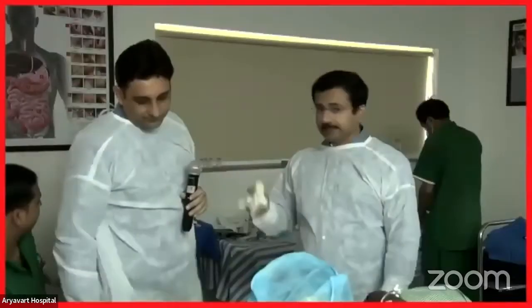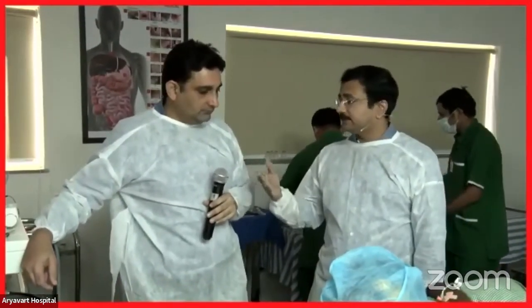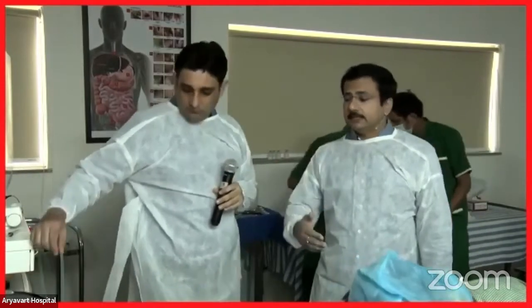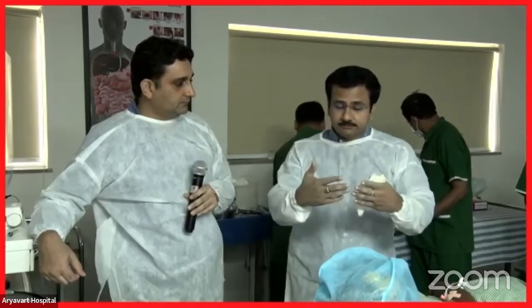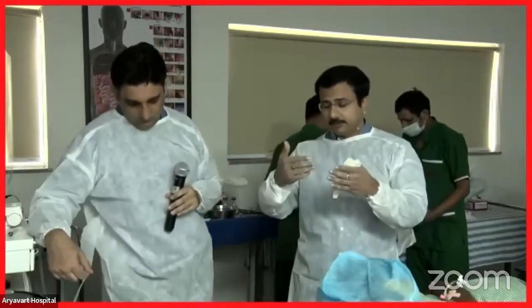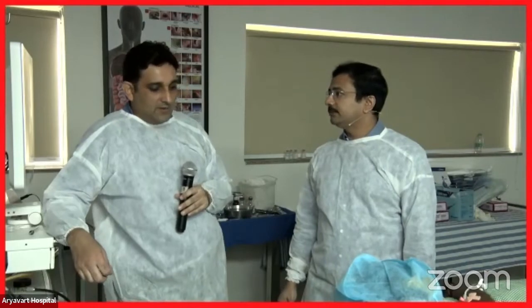One more thing to highlight: even when the varix is large — say 3 or 4 centimeters — it is the number of coils that we increase. The maximum coil diameter available is 2 cm, so you pack the varix with multiple coils of 2 cm. Go to the distal part first, then gradually pull back the needle, deploying coils one after another — this becomes a large scaffold. Then inject glue. Glue is always 1 to 2 mL, maximum 3 mL.